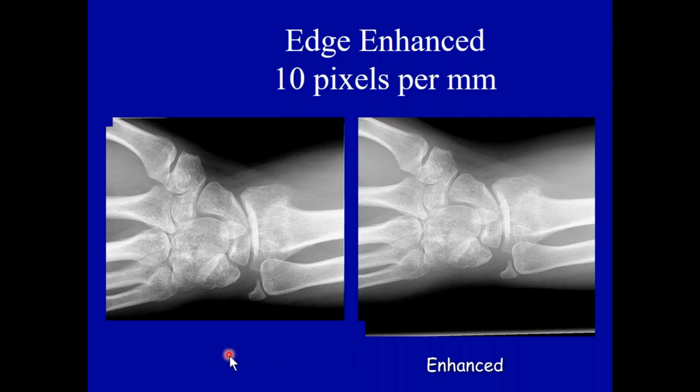If there's computer enhancing software inside of it that's being used, whether you realize it or not, I can see more information. I can see more lines inside the osseous structures, the radius and the ulna, and those little lines are called trabeculae. If the trabeculae are altered in some way, shape, or form, then we can tell about subtle fractures. So the better the technology becomes, the basic principles of positioning don't change for you, but it allows the doctor to make evaluations. In other words, it's a digital magnifying glass.